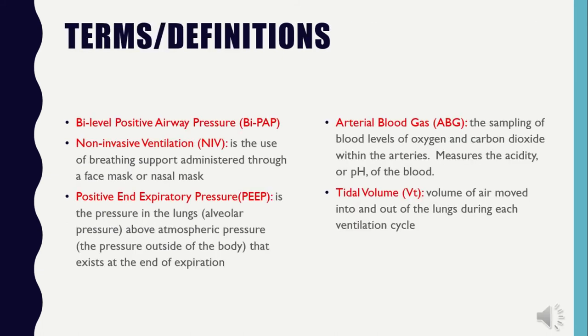Okay, here's a review of the common terms and definitions we'll be using. Of course, the first one already mentioned, the BiPAP. Our second one can sometimes be used interchangeably with the BiPAP term. It's NIV, non-invasive ventilation. It's the use of breathing support administered through a face mask or nasal mask, anything but invasive.